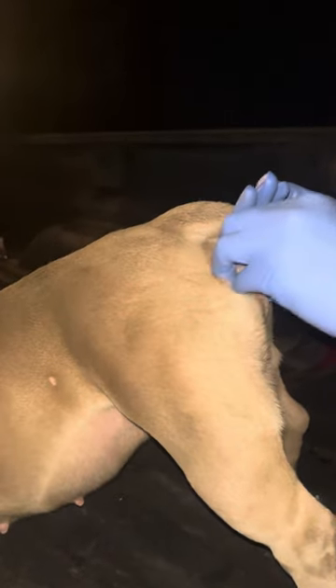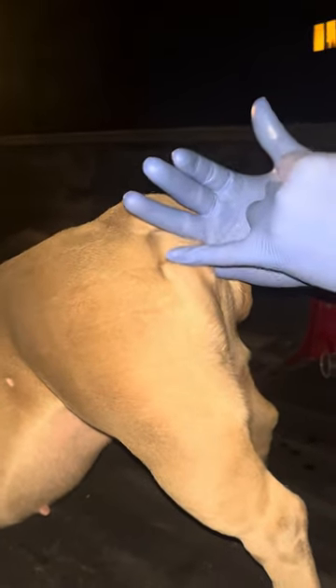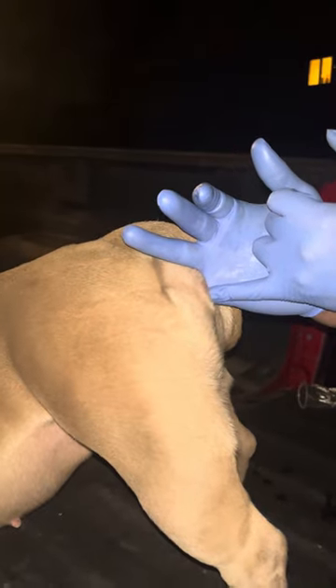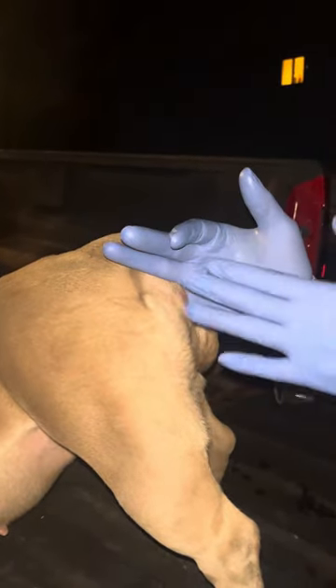Like I said, I ordered the kit off Amazon. I came without it — giving you free game. Use a pinky. And then when you get that pinky to the hole, make sure the straw is on the left of it. Okay, and you go to the left of it. All right. Got you.